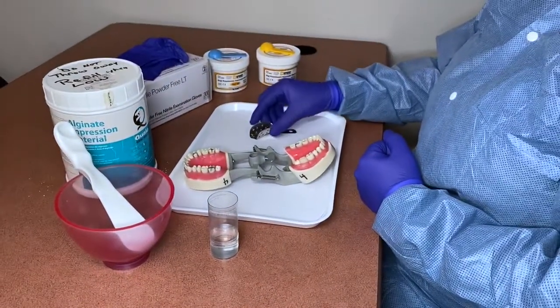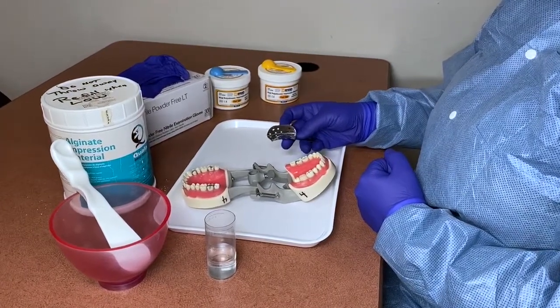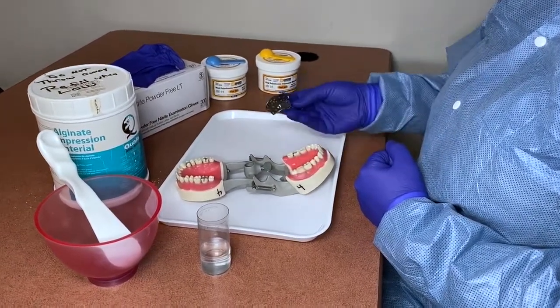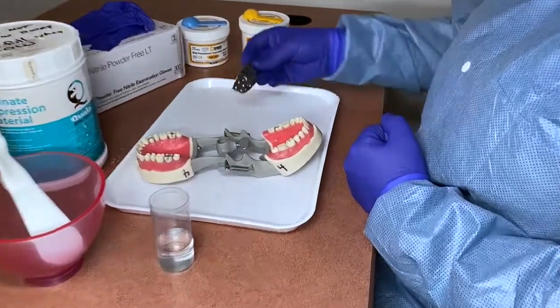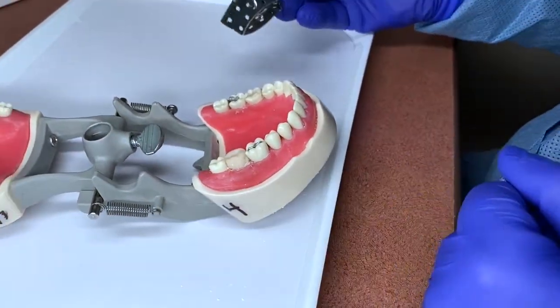The first step in fabricating a temporary crown is to take a preliminary impression of the tooth before the doctor preps it, so that you're capturing the anatomy of the tooth when making your temporary.